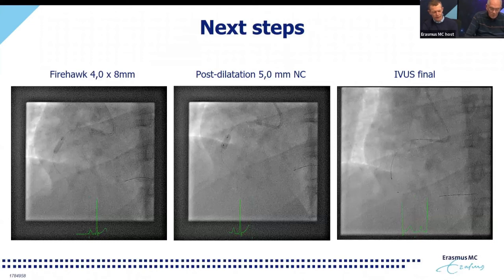Typically in these cases, I don't make angios in between all the individual maneuvers, because IVUS will simply show you the result. The good thing about using IVUS in STEMI cases, and in general, is that you can really reduce your contrast volumes. As long as the patient is stable, with no new ST segment elevations or arrhythmias, the likelihood of severe acute problems that cannot wait another 30 seconds for your IVUS run is highly unlikely.